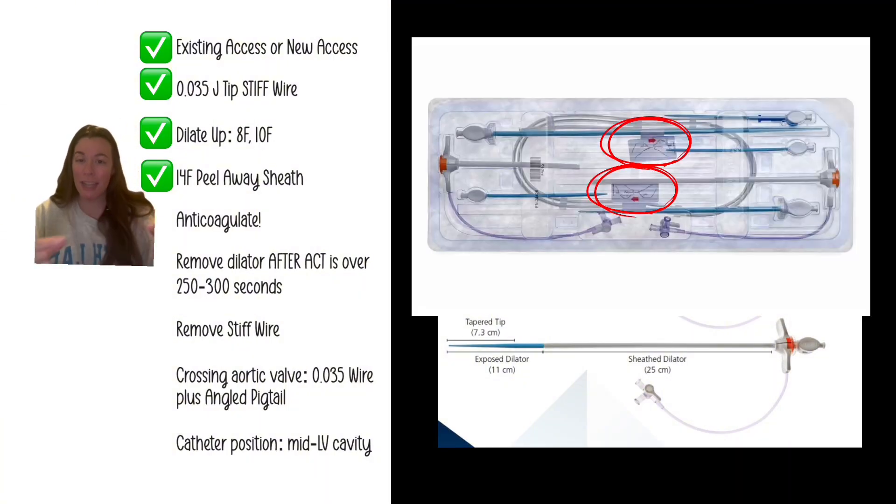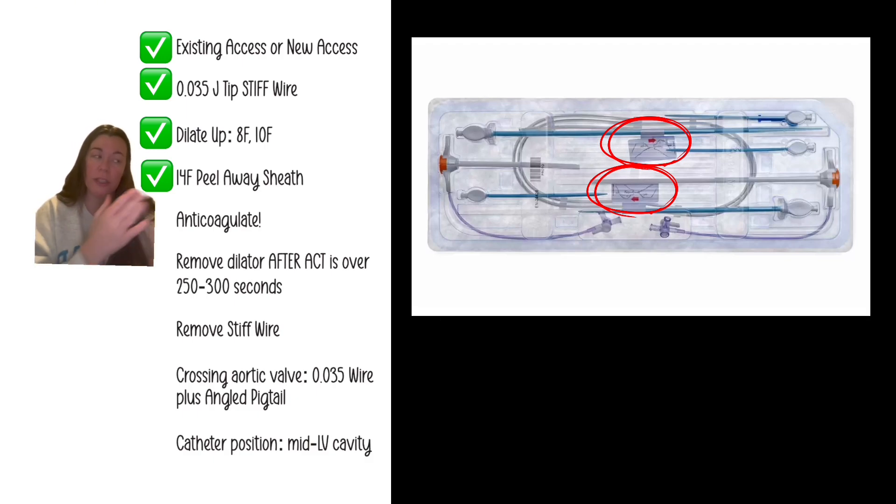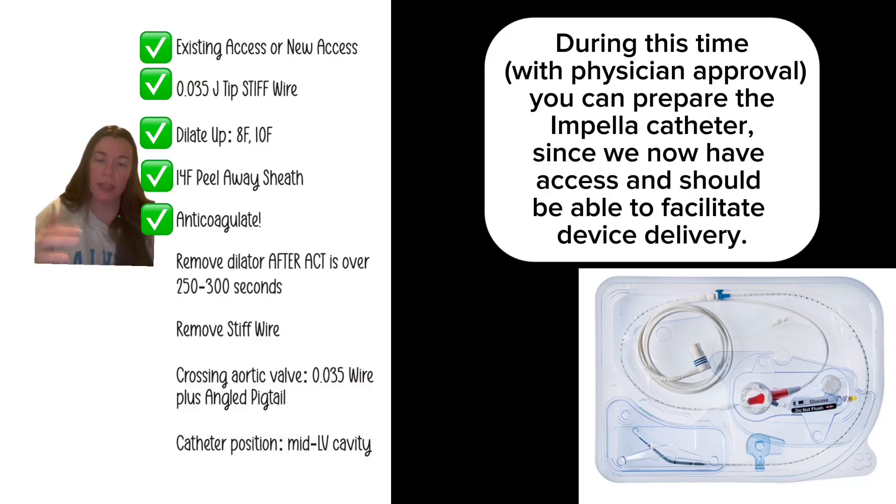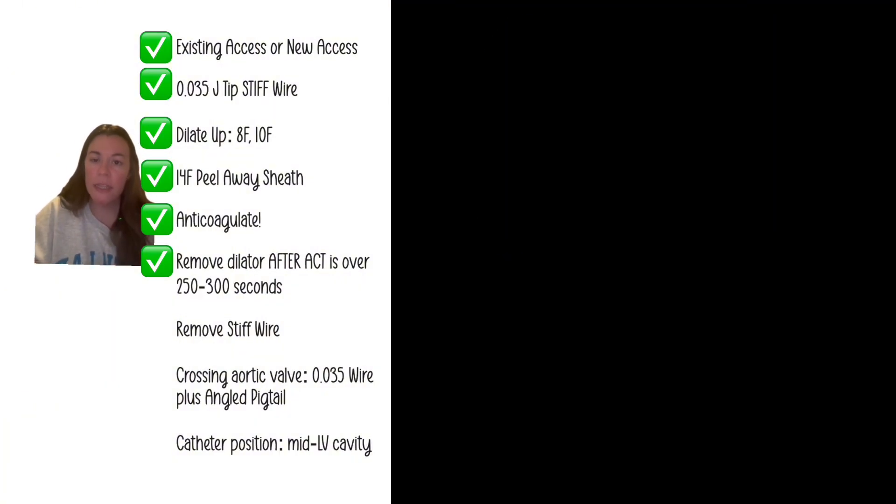Notice the dilator has a covering because there's lubricant on it, which gets inside the 14 French sheath to help facilitate delivery of the device later. If you take off that cover, don't wipe off all the lubricant — you want it there. After inserting the sheath, anticoagulate and make sure the ACT is therapeutic — 250 to 300 depending on your ACT machine — before you remove the dilator. It's a large sheath, and stagnant blood will coagulate if you remove the dilator too early.